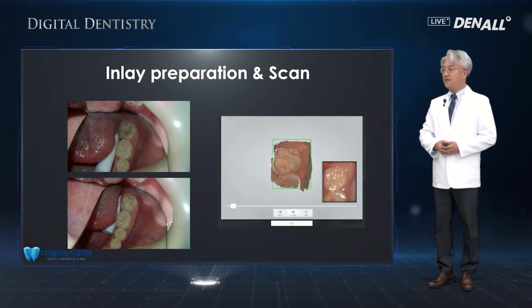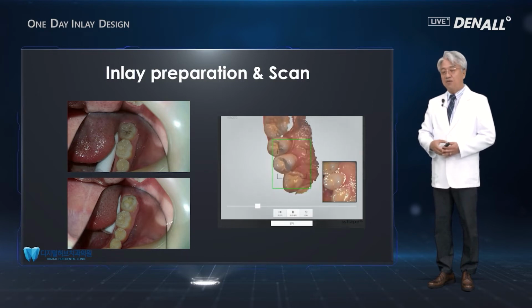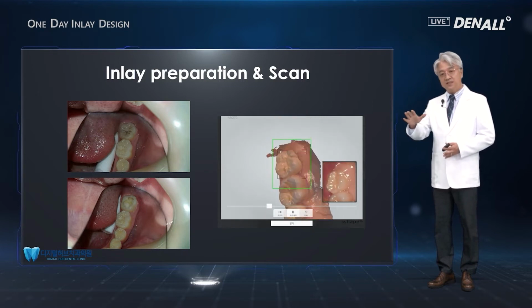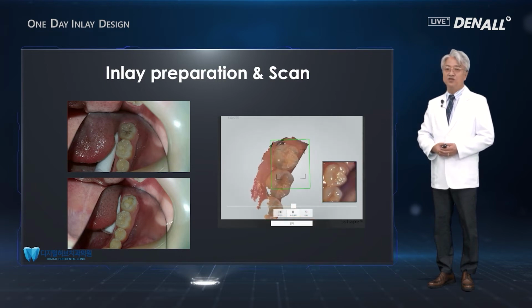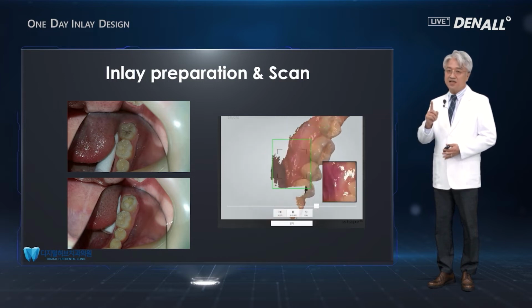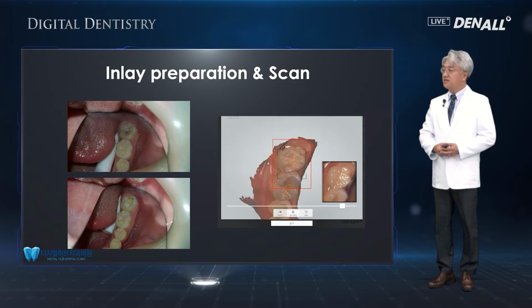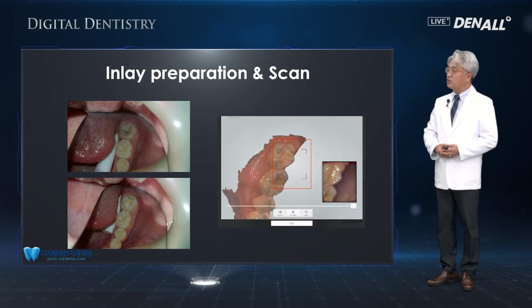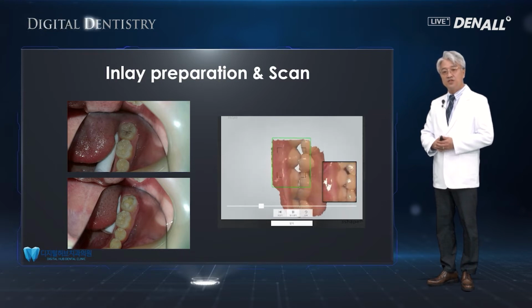But in the case of inlay, if you just do thorough scanning, then without much problem, you can do good prosthesis production. So in inlay, the difficulty of scan is the least in using the CAD-CAM.